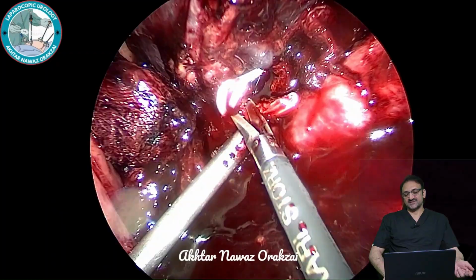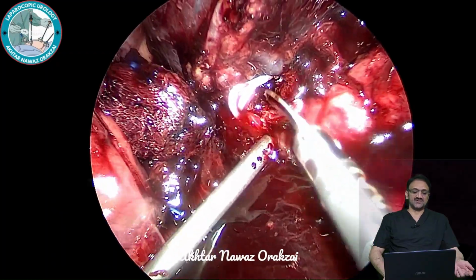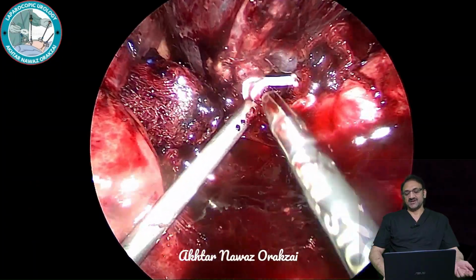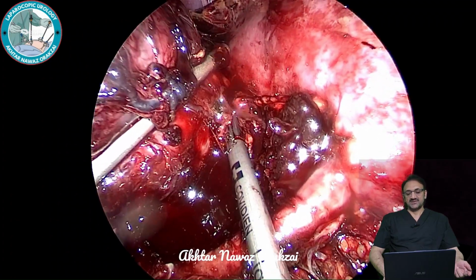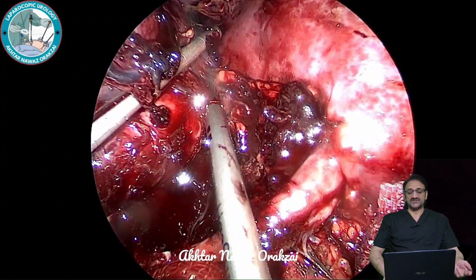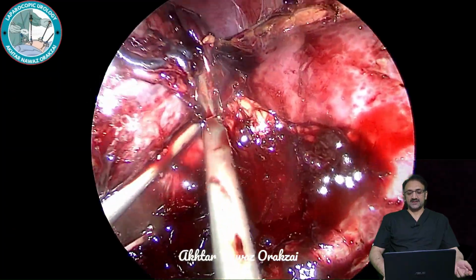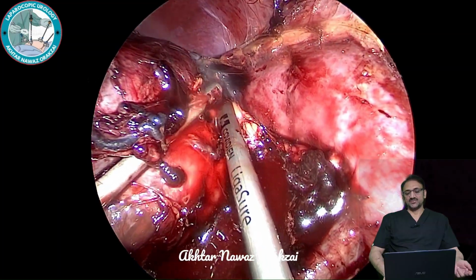Now the things are a little in our favor. At least we are not fearing the injury to the renal hilum or the main vessels. So now we have increased the pressure to 14. Here you can see that again that engorged vein is opened.